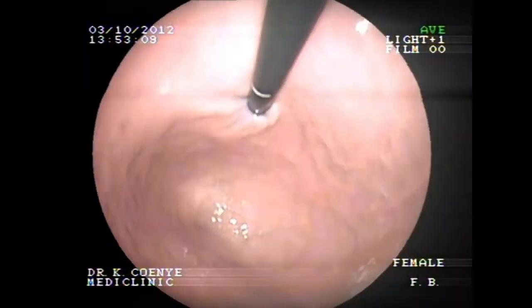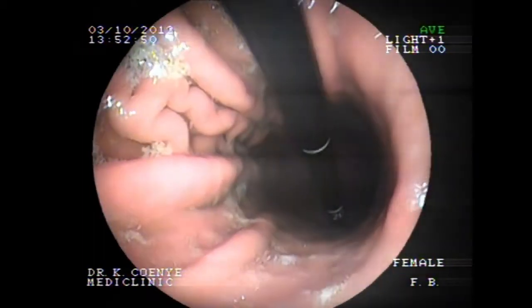In our experience, the presence of a hiatal hernia is not a contraindication to the placement of the balloon.